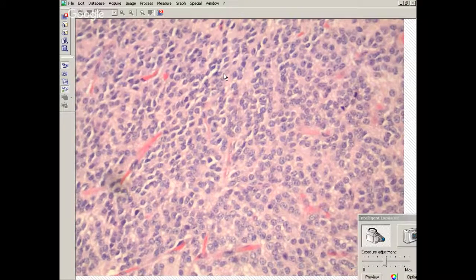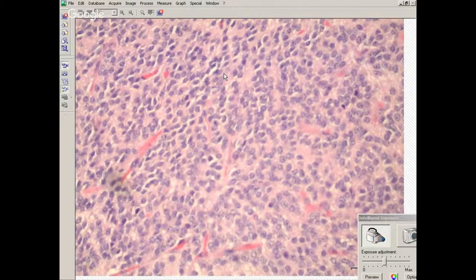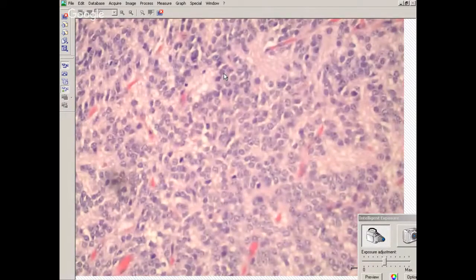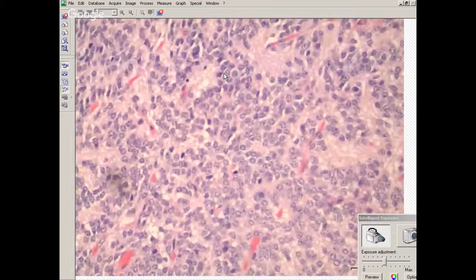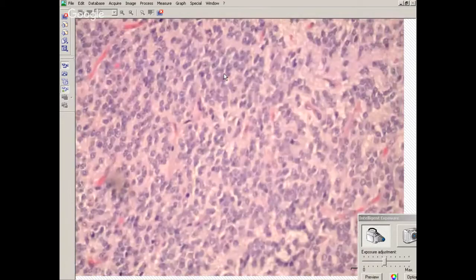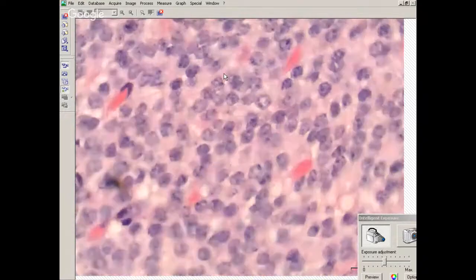Yeah, so this wouldn't be this type of morphology. Choroid plexus papilloma would end up being papillary fronds of what look like similar morphology to normal choroid plexus, but it's too many fronds of the choroid plexus. But this is not that. So it's a fairly uniform population of tumor cells. The nuclei look fairly homogeneous. Does anybody see any mitotic figures? Probably one or two, I'm not very sure. No mitotic figures.